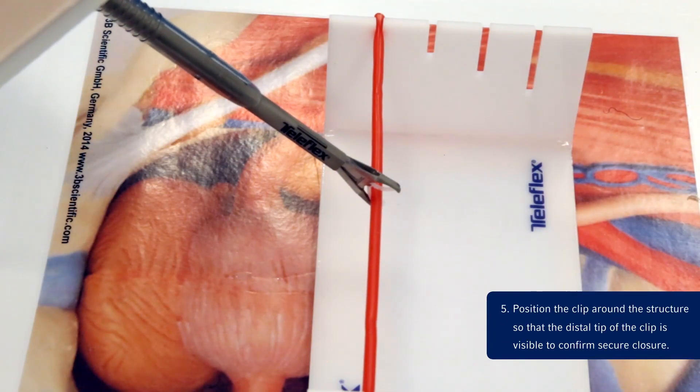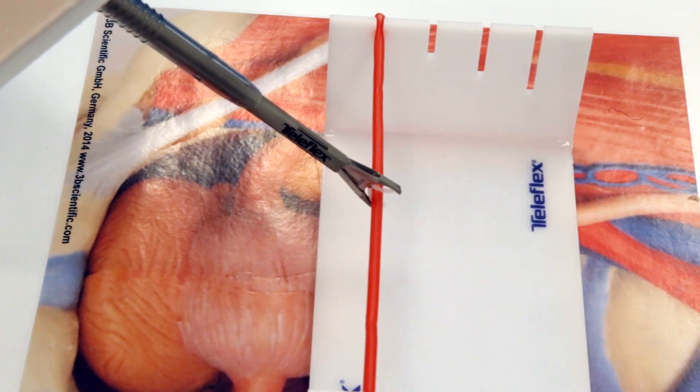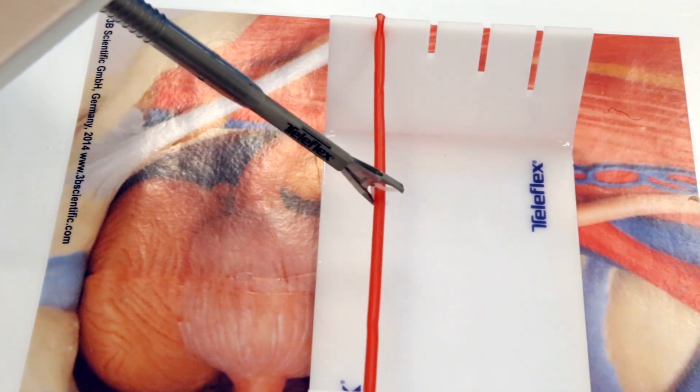Step 5: Position the clip around the tissue to be ligated in a manner that provides clear visualization of the locking mechanism. Squeeze the trigger fully until a definitive click is heard. Push the device forward gently and fully release the trigger to complete the firing sequence.